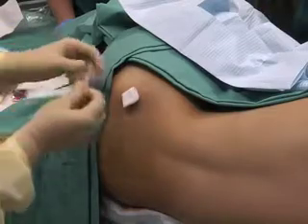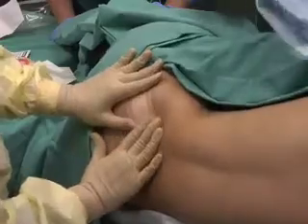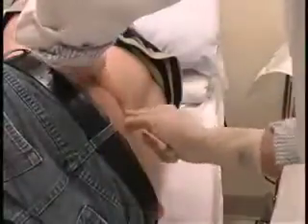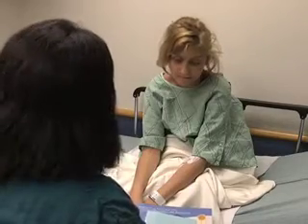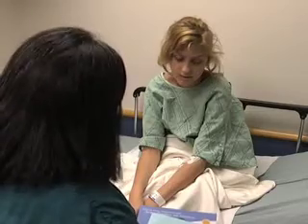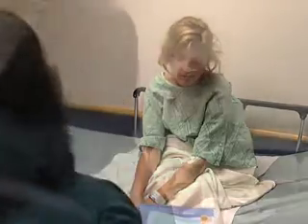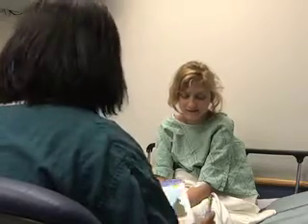Instruct the patient that the dressing can be removed the next day, and that they should protect the wound from contact with water until a firm scab is formed. Any substantial bleeding from the site should be reported to the physician. The patient may experience soreness at the biopsy site for 1 to 2 days that is best controlled with oral analgesics. The patient should be instructed that anything out of the ordinary should prompt physician evaluation.